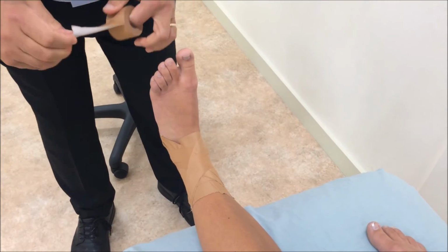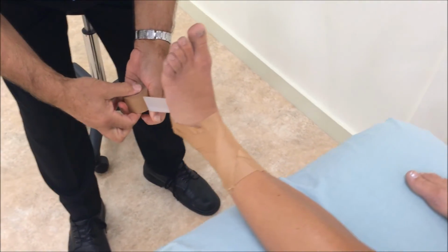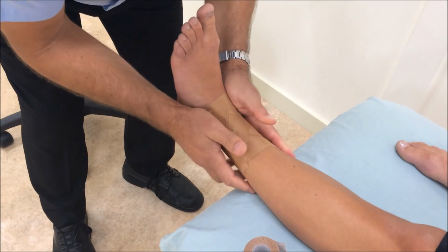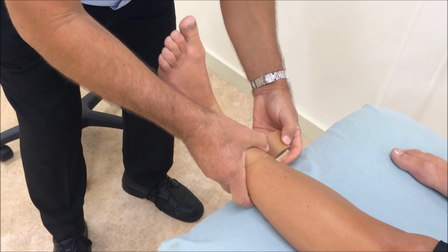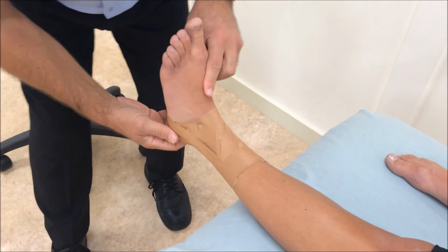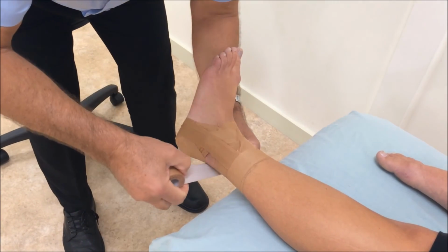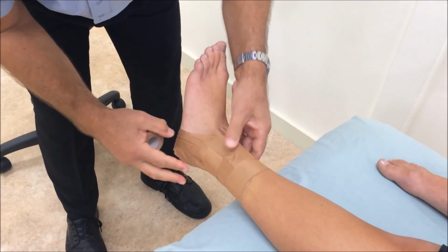Continuing, we go to the figure 6, starting on the outside of the anchor. Again, we'll just do one on this size ankle, come underneath the heel, roll off up to the anchor, cut it or tear it, apply a bit of pressure, tape it down, lock off the ends gently with a circular, remember, no real pressure on any circulars. And then, as I said before, check for any pieces of skin that might be bare and just tape over to protect them from blisters or tape cuts.